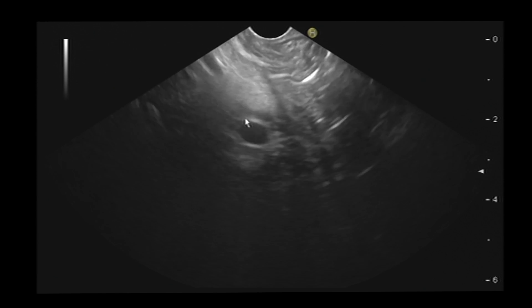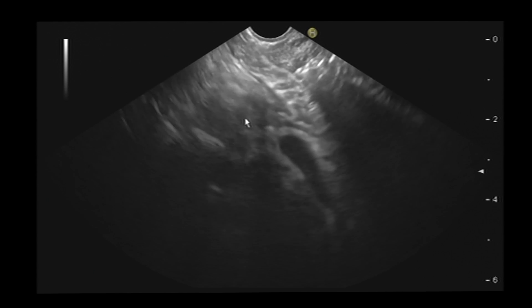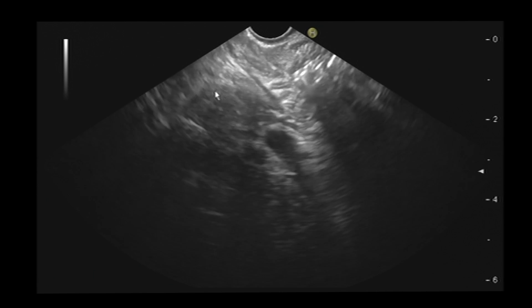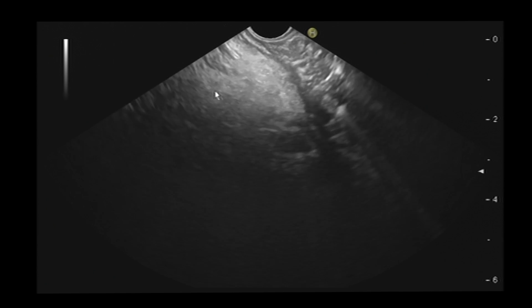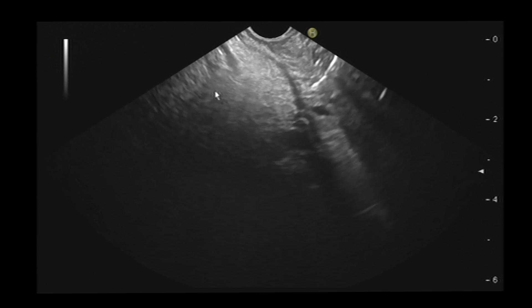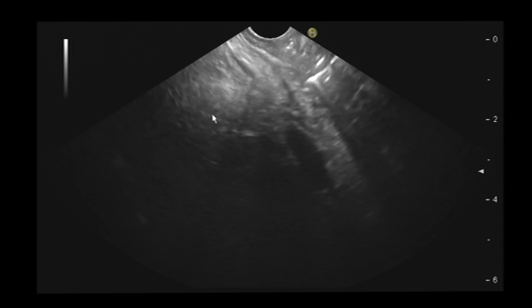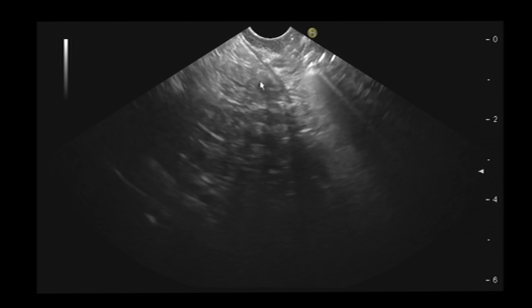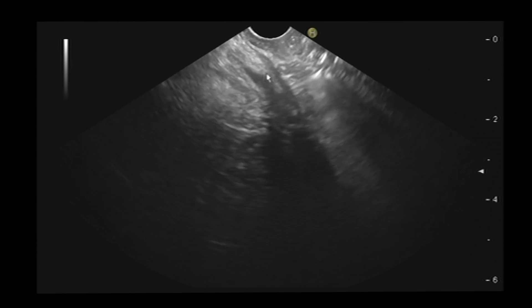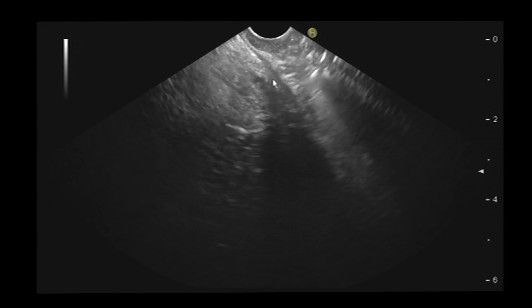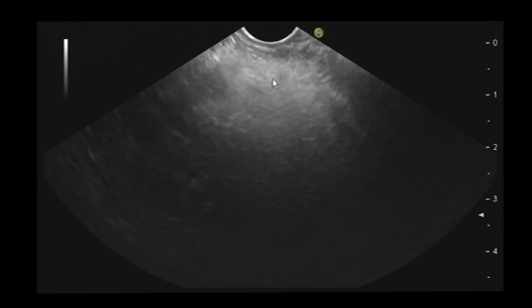Here we have the head of the pancreas, just here. And we have the bile duct — this is the bile duct. It's not dilated.